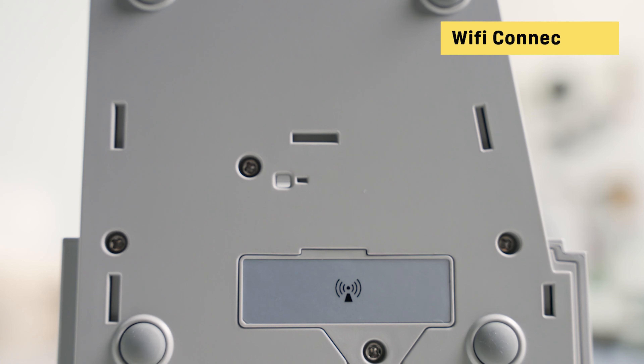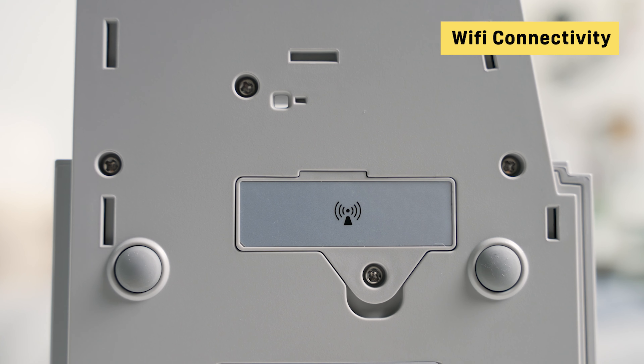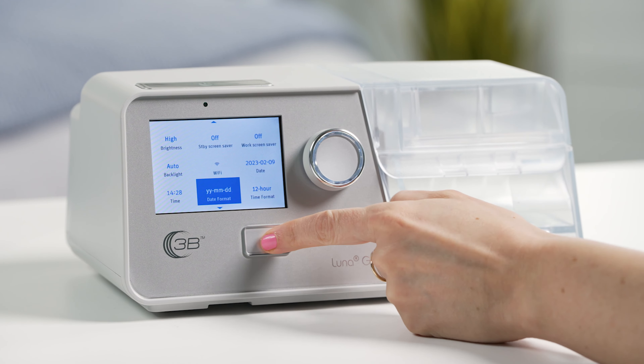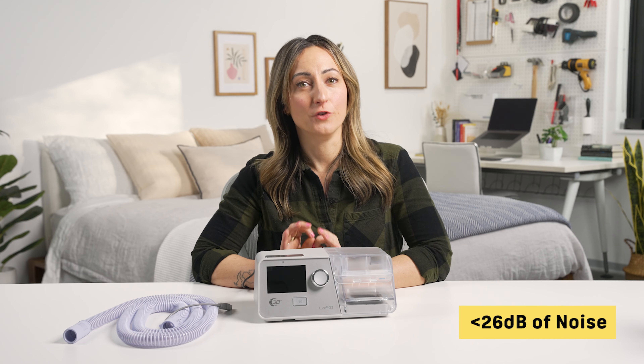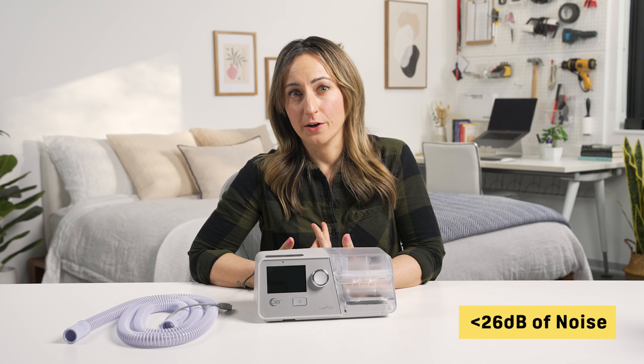Finally, the Luna G3 also has a built-in modem with Wi-Fi connectivity, which lets you automatically send sleep data to your doctor. Since you need to regularly submit CPAP data to your doctor, the Wi-Fi connection makes that process much easier. There are a few areas where the Luna G3 outperforms the competition. One thing we really like is just how quiet the machine is — the G3 produces less than 26 decibels of noise, which is comparable to a whisper and much quieter than the average BPAP machine.